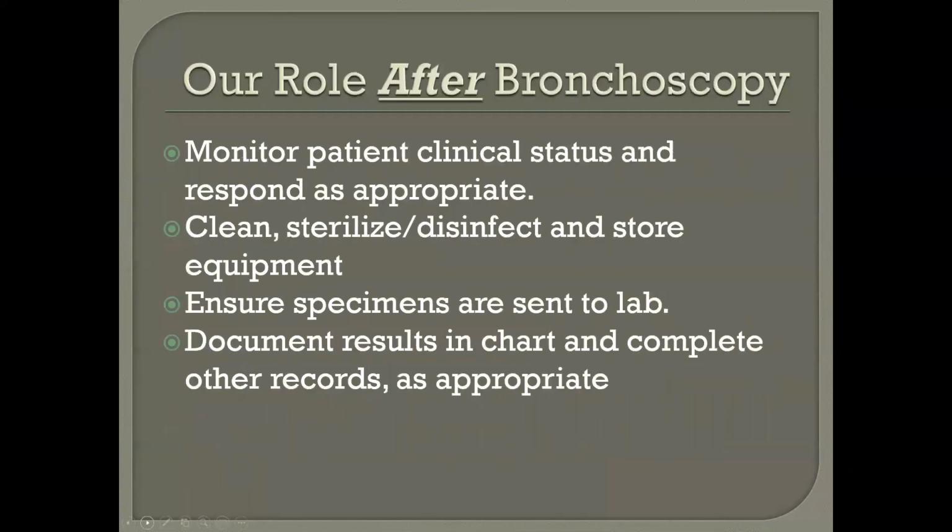After bronchoscopy, monitor the patient's clinical status and respond as appropriate. Clean, sterilize, disinfect, and store the equipment. Ensure the specimens are sent to the lab, document results in the chart, and complete other records as appropriate.